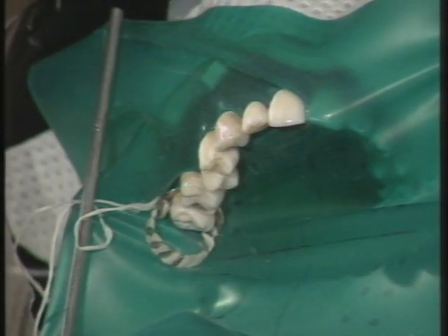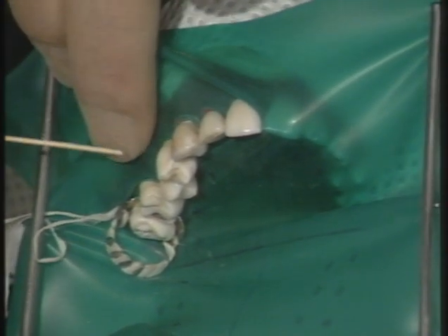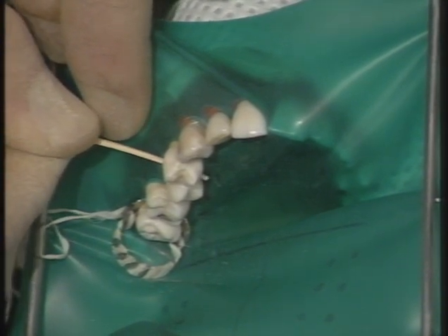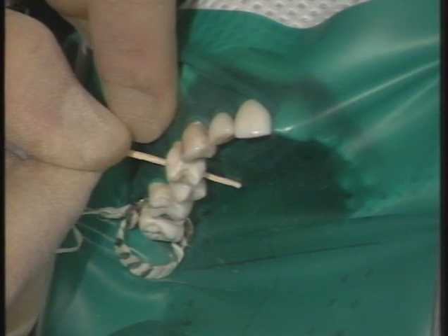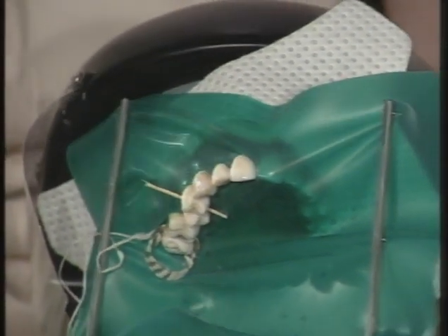And the last thing that we have to do is to place an interproximal wedge. The wedge has been lightly lubricated, and can be placed into the contact area with light finger pressure. This can be aided by pulling the dam slightly out of the way so that the movement of the dam into the contact carries the wedge with it, and once it's in position, it can be broken to a more convenient length. And there you have the dam in position.